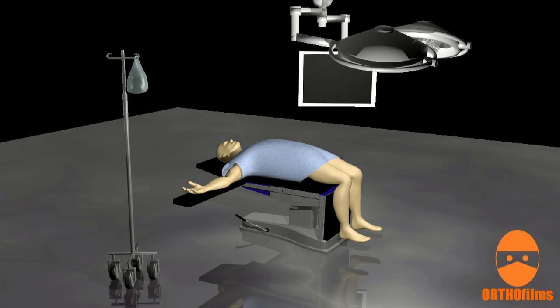ACL reconstruction surgery is usually done arthroscopically. This means that the knee is not cut open to expose the joint. Instead, a camera is inserted into the joint so that the surgeon can visualize the operative site.